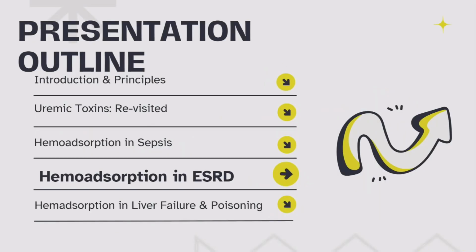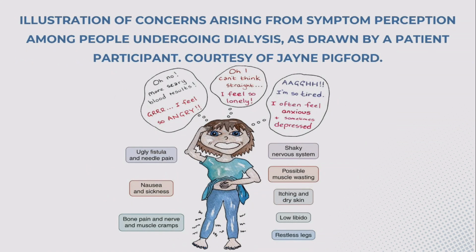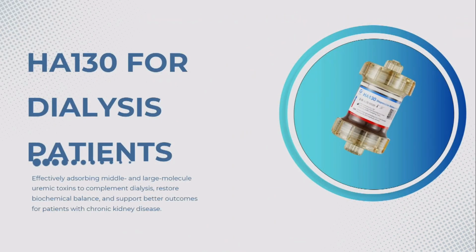What about ESRD? This was a KDIGO conference. I just like this KDIGO conference because it was a conference where patients participated. We are all discussing the patients, and I cannot see any patient here. This patient has drawn this diagram and told what she is suffering from. She suffers from fistula pain, shaky nervous systems, itching, restless leg syndrome and all that. So this KDIGO conference addressed this by talking about the usefulness of hemadsorption.